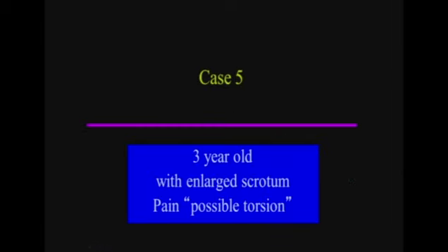Another case, a 3-year-old with an enlarged scrotum, and we were told to evaluate the patient for pain, possible torsion. We were told to come in emergently. It wasn't we, it was me. And we came in for this emergency.